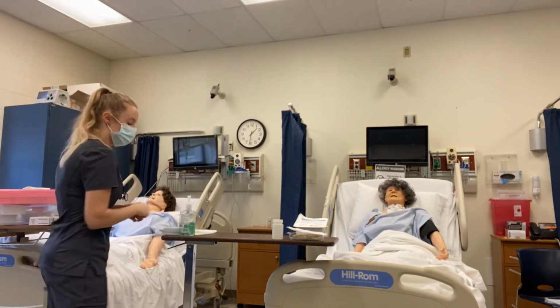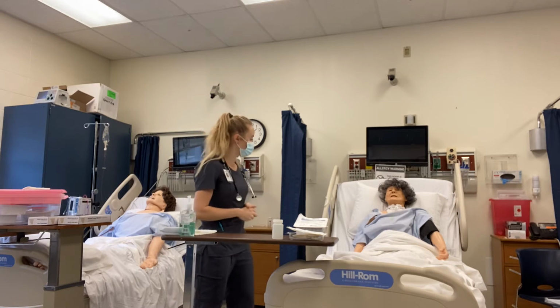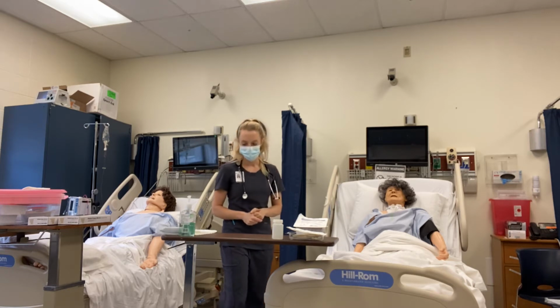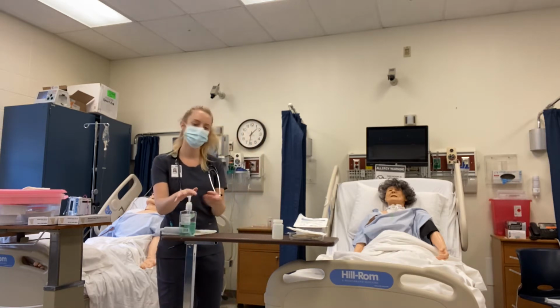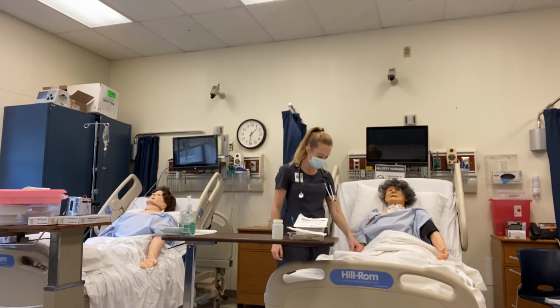Hi, Mrs. Jones. My name is Grace. I'm going to be your nurse today. Today we're going to be suctioning out some of those secretions from your tracheostomy, okay? I want to perform hand hygiene, provide client privacy. Can you verify your name and date of birth for me?